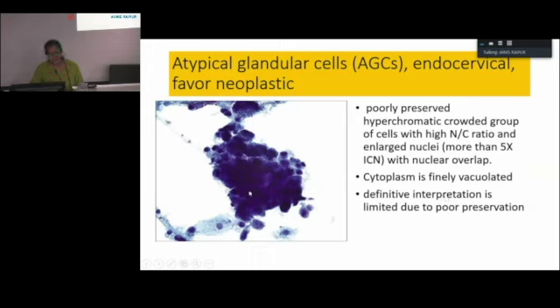As you can see in this, it's kind of smudged chromatin. The morphology is not very, very clear. So whenever you give a diagnosis of atypia, please qualify what the atypia is because of. Maybe it is a preservation artifact. So put it in your comment.